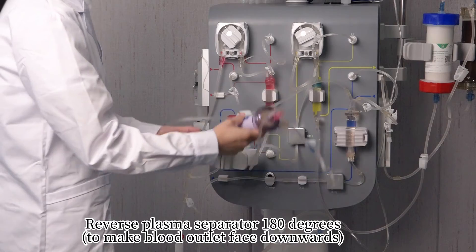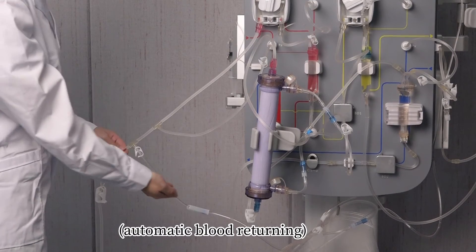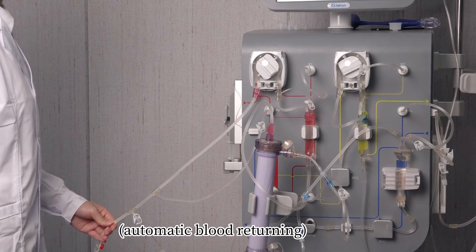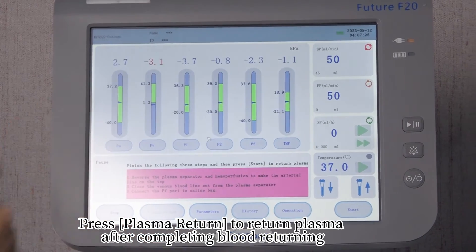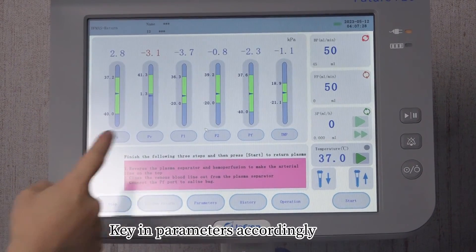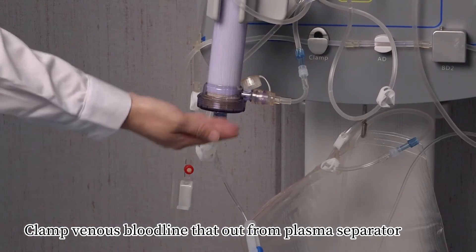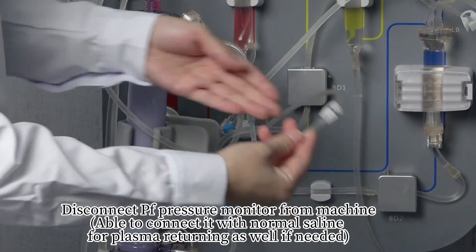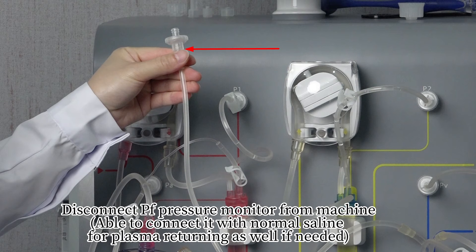Reverse the plasma separator 180 degrees to make the blood outlet face downwards. Press 'Plasma Return' to return plasma after completing blood returning. Key in parameters accordingly. Clamp the venous bloodline dead-end from the plasma separator. Disconnect the PF pressure monitor from the machine. You may also connect it with normal saline for plasma returning if needed.